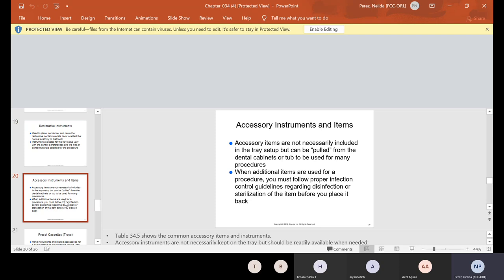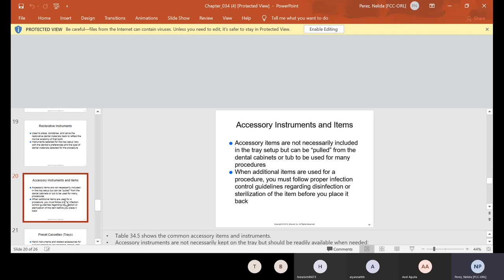Then the next instruments after restorative is accessory. So accessory items are not necessarily included in the tray setup, but can be pulled from the dental cabinets or tub to be used for many procedures or the drawer. I'll tell you guys to leave them on the side just in case you don't use them because as soon as they touch anything that's contaminated, that's contaminated also. So if you don't need it, then it's far away from your contaminated instruments. If you do need it, it's also very easily for you to grasp and get it instead of you opening up drawers and things like that. So when additional items are used for a procedure, you must follow proper infection control guidelines regarding disinfection or sterilization of the item before you place it back.